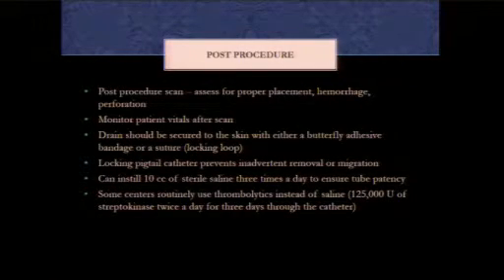So after your procedure, everything went well and you're all happy, but you want to assess for any complications. So you want to assess for proper placement of your tube, hemorrhage, and perforation by doing a few slices through where you've put your catheter. And you obviously want to monitor your patient's vitals after the scan.